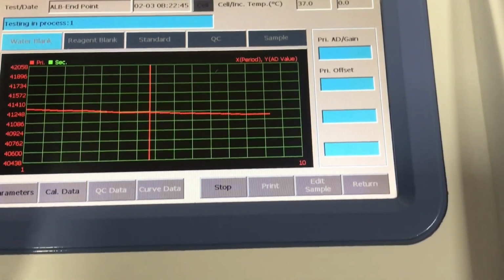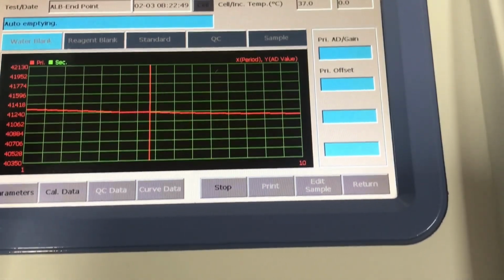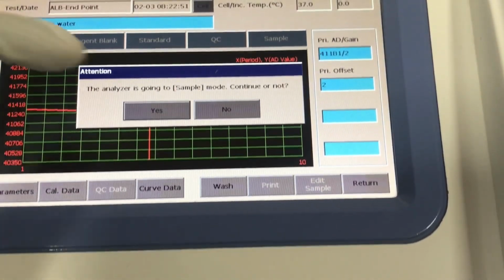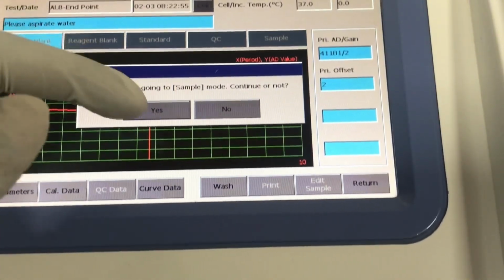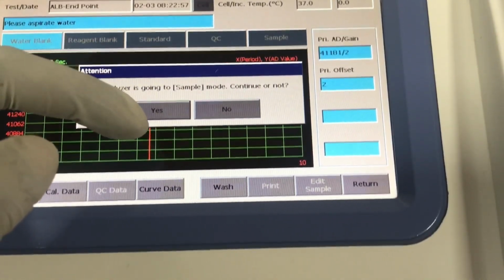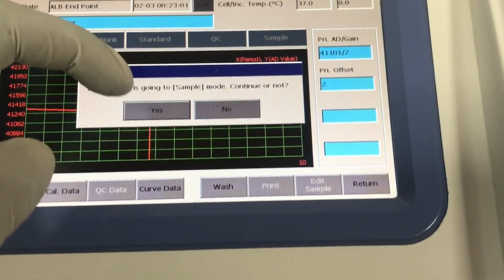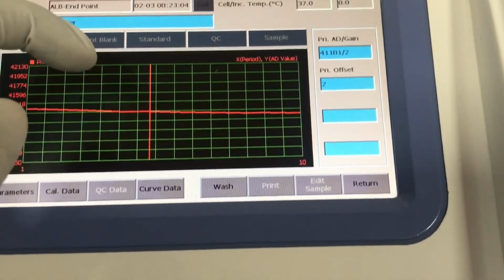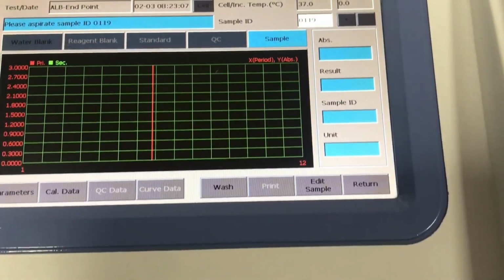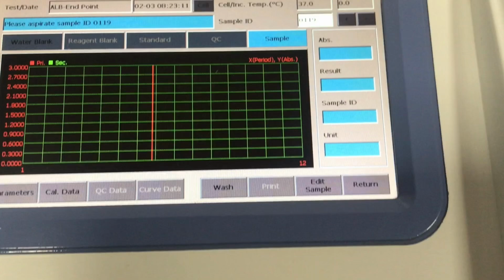So the water has aspirated, the graph is okay, and I'm going to go through all 20 of them just to explain a few things concerning precision and then accuracy to you. So as we measure them, I'm going to talk about systematic error, random error, trends, and then shifts. So this is my preparation. I have it here. I'm going to measure it.